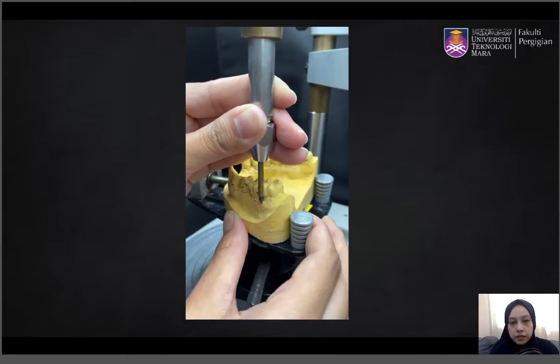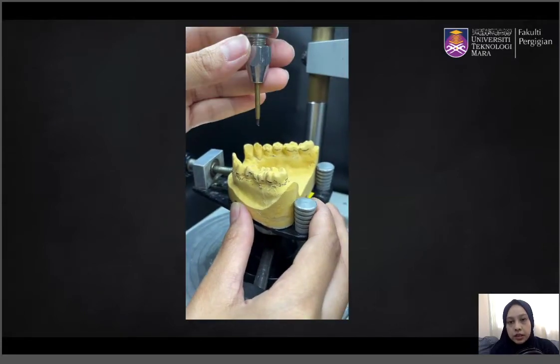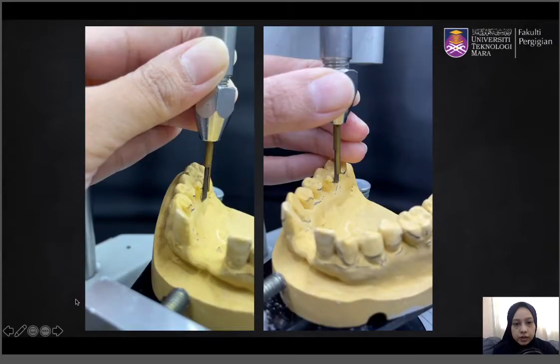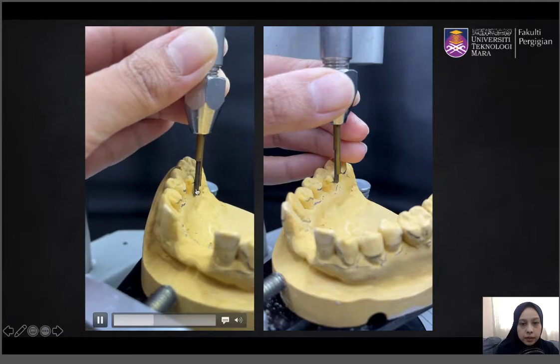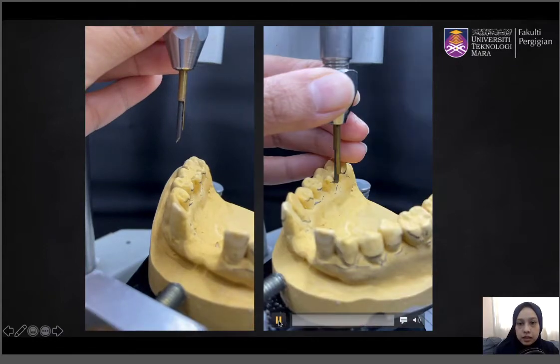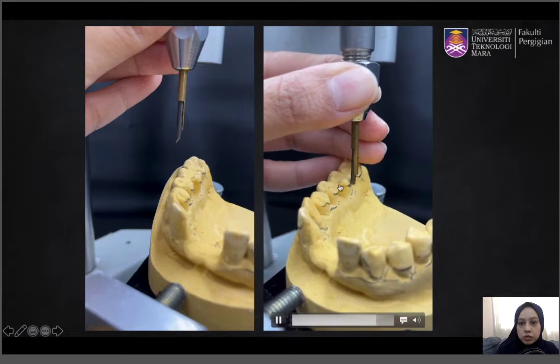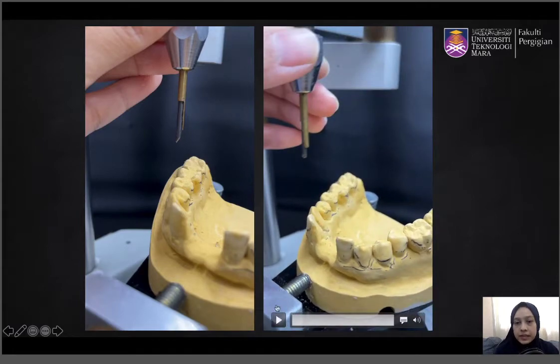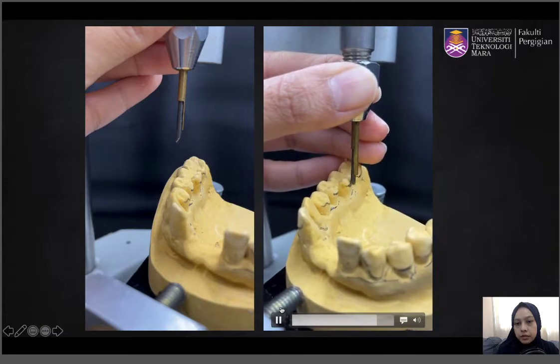At the end of the survey, you should have two lines: one line on the most bulbous part of the tooth and another line on the gingival area. This close-up shows the correct positioning of the carbon marker — it must be brought all the way down to the gingival margin. The wrong technique is when the carbon marker is only brought to any arbitrary level, creating a danger that you mark something other than the most bulbous part of the tooth.